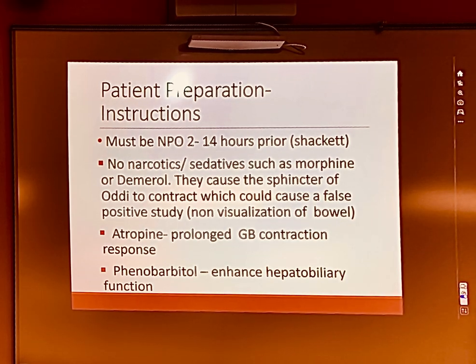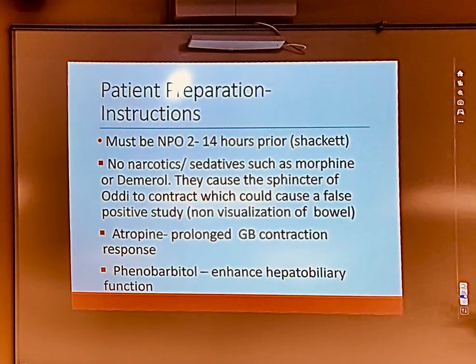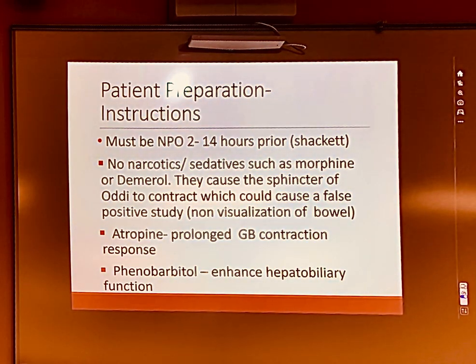call the radiologist, when do you want me to start or stop imaging? Because any radiologist will have to look and see how long the patient's been on atropine, because that will change, because it builds up in the system, right?